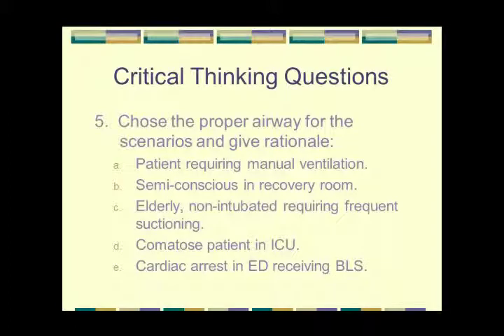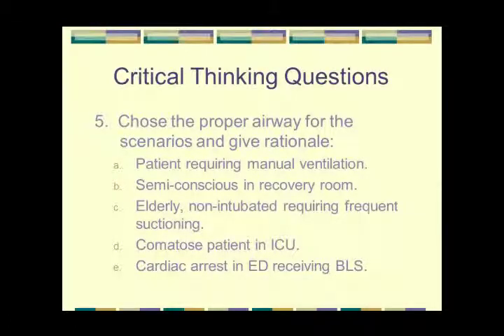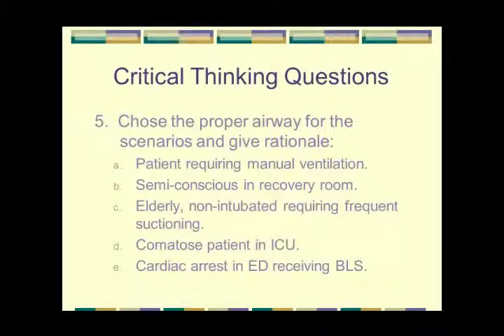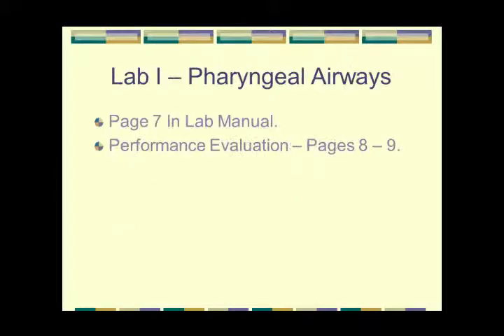Skip one. Requiring manual ventilation? Either of them. Just something to pull the tongue off the posterior pharynx. Helps you manage the airway better, having something there rather than you holding it and trying to manage it that way. And we'll let those guys go.